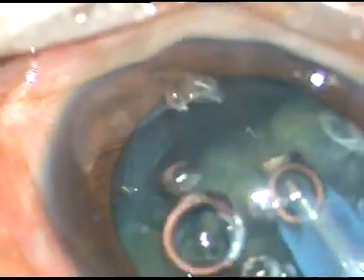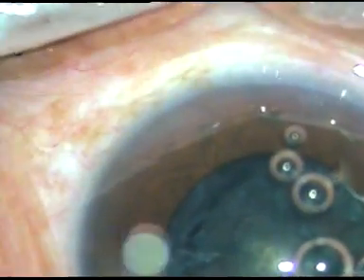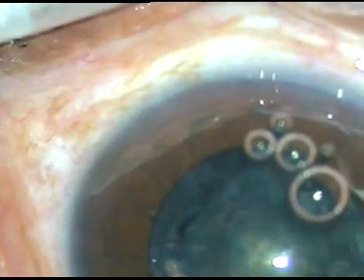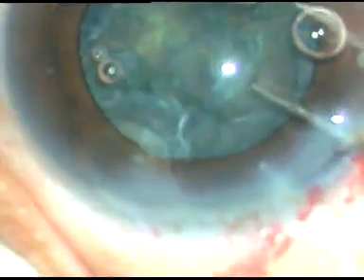Removing this hemi-nucleus is very easy. I just go into the eye with the phaco handpiece and apply very little energy — about 20% phaco energy — to remove the hemi-nucleus. The other hemi-nucleus has gone into the capsular bag. Let us see how it was managed — using a Simcoe cannula.